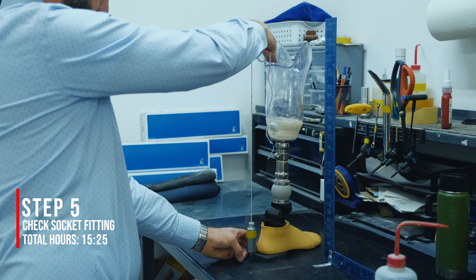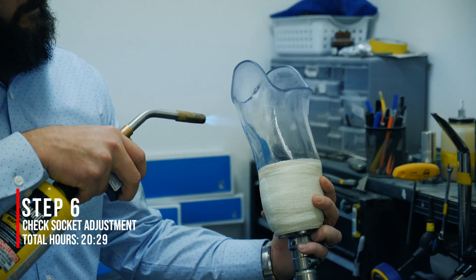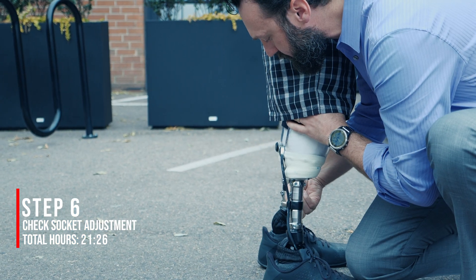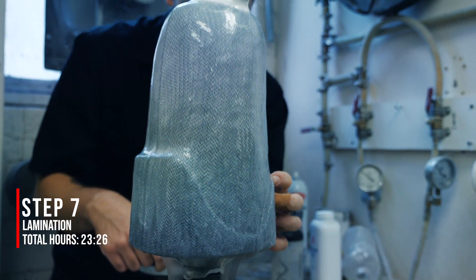We are then ready for patient fitting and alignment. The check socket may need to be adjusted multiple times before the correct fit is achieved. When the patient is satisfied with the fit and comfort, we go to the final step: lamination.